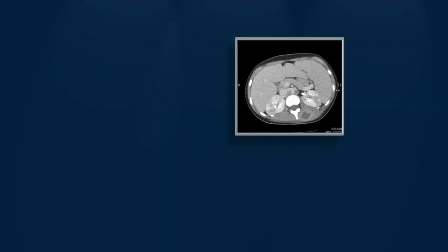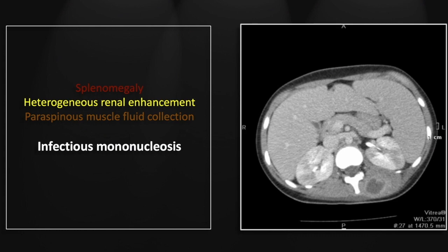Our next case is infectious mononucleosis in a child. There is marked enlargement of the spleen to tip you to the diagnosis. In addition, there are multiple foci of heterogeneous renal parenchymal hypodensity that look for all the world like underperfusion or more likely multifocal pyelonephritis — what this ultimately amounts to is a viral nephritis. An important finding here is a paravertebral soft tissue fluid collection consistent with an abscess, a manifestation of the immune suppression that goes along with EBV infection.